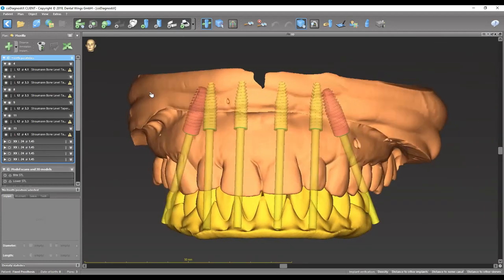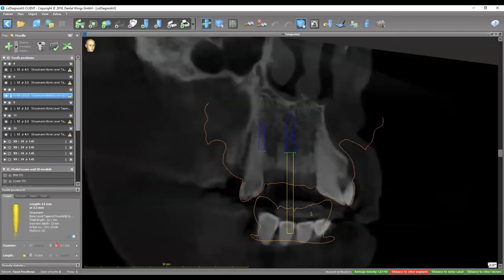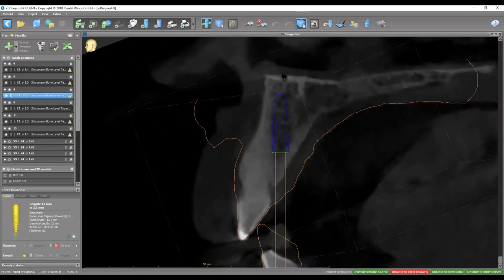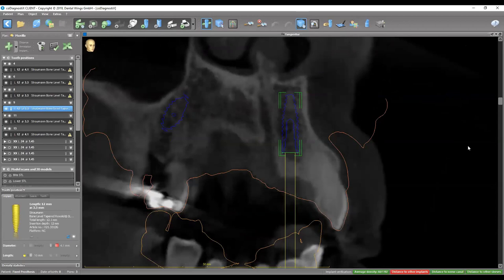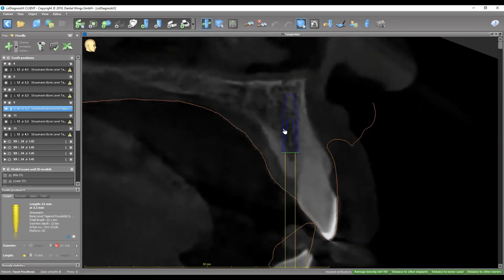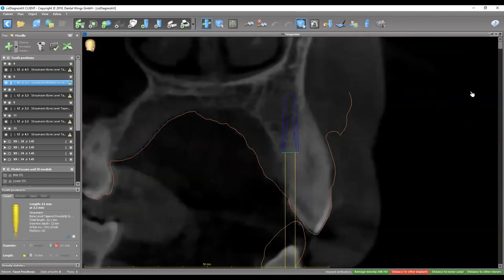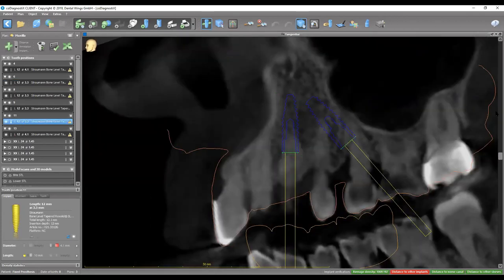Going over each implant site — starting with number 8: a 3.3 by 12. The implant emerges out of the cingulum or slightly lingual to it, with good bone support on both buccal and lingual surfaces. Rotating, you can see the nasopalatine and we've made sure the distance is more than 1.5 to 2 millimeters. Number 9 — good bone support on both surfaces, angulation towards the cingulum or slightly lingual. The canine implants, number 6 and number 11 — both look really good. Those anterior implants are pretty straightforward.